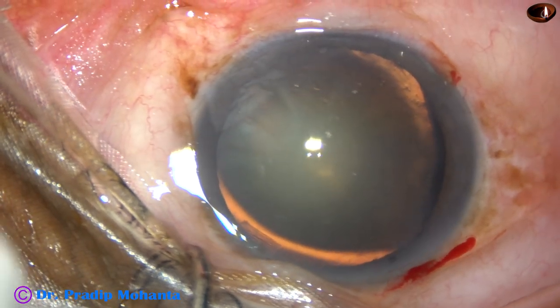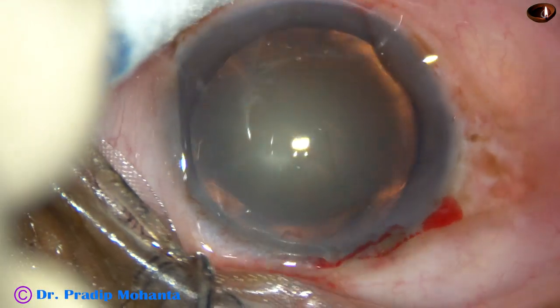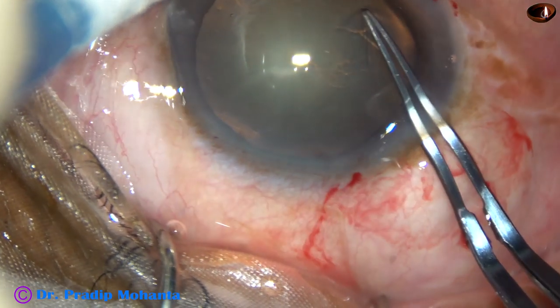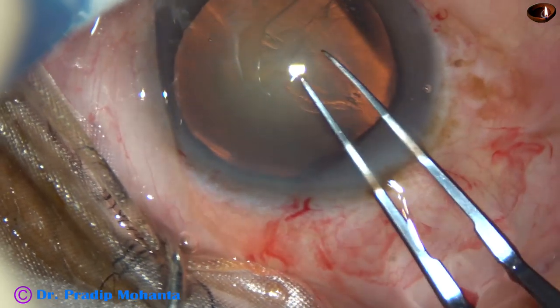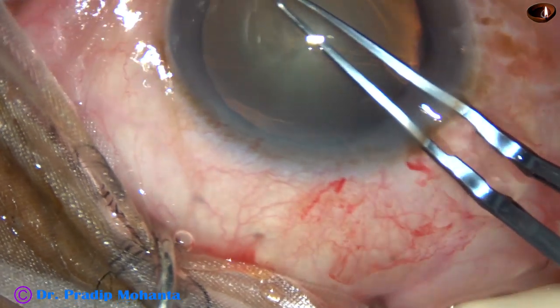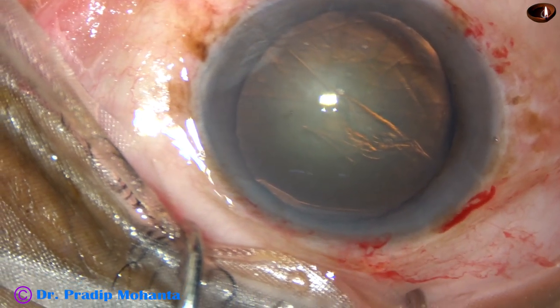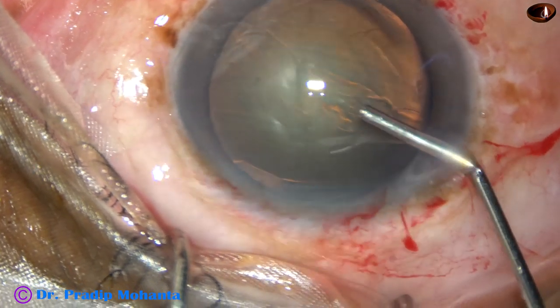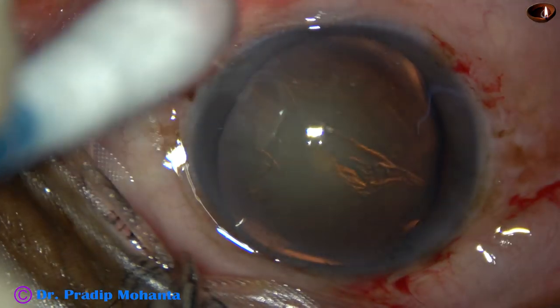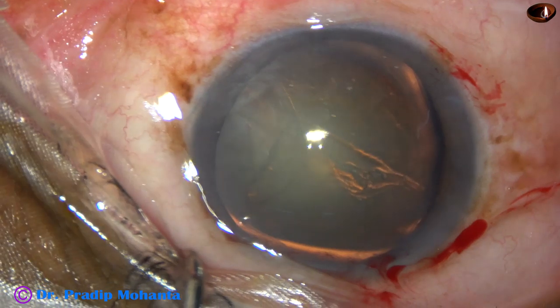Now, capsulorhexis. As I make the incision on the capsule, I can make out that there is weak zonule. And as I do the rhexis, there is wrinkling of the anterior capsule in the subluxated area. I come out because the anterior chamber became shallow, so I inject some viscoelastic — this is 2% HPMC. Then I introduce the rhexis forceps again and complete the rhexis.